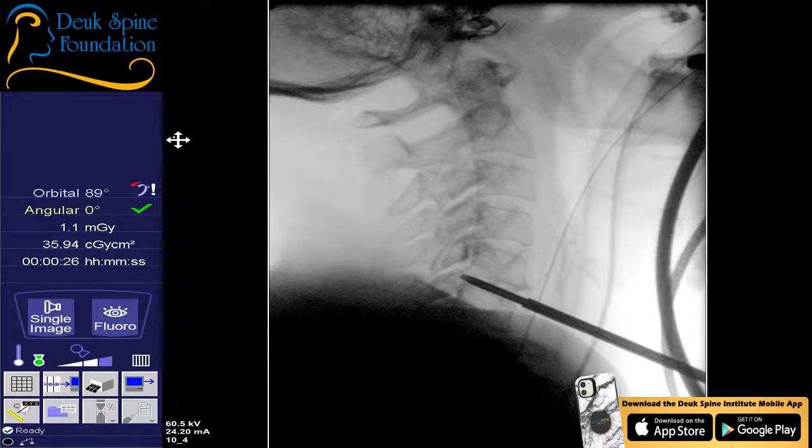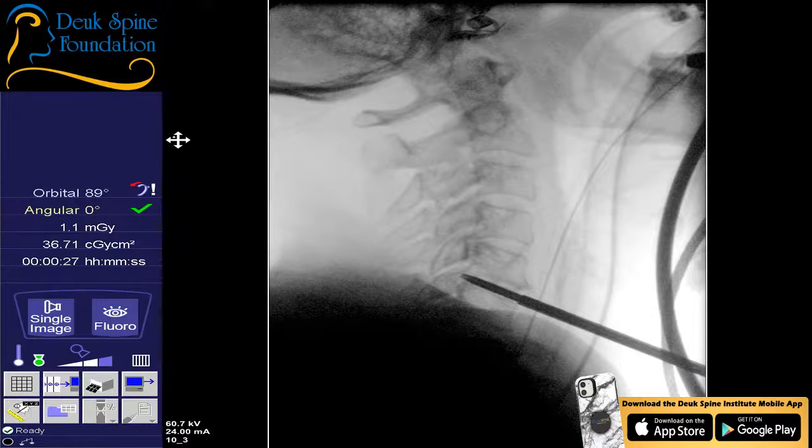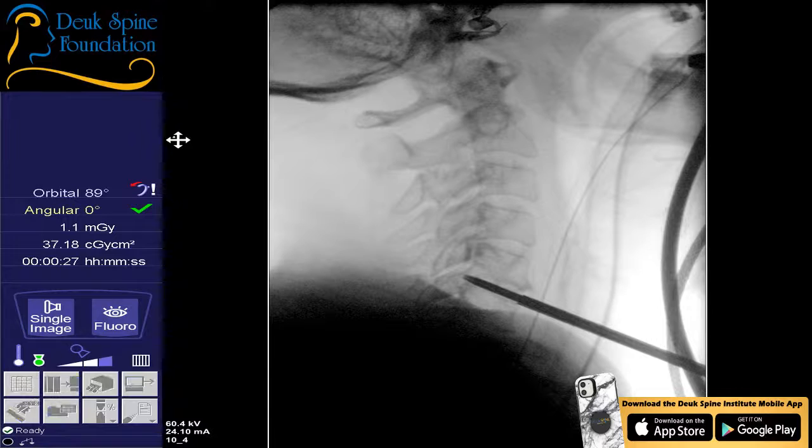You need to take a shot every time I look up and stop. How's our patient? So far, so good. I'm going to do very small advancements here. At some point I'm going to pull this dilator back just a little bit — I don't want it to accidentally advance into the spinal canal and injure the spinal cord or the nerve.